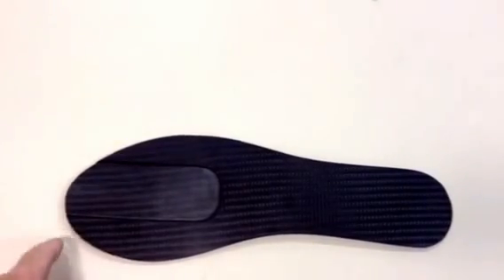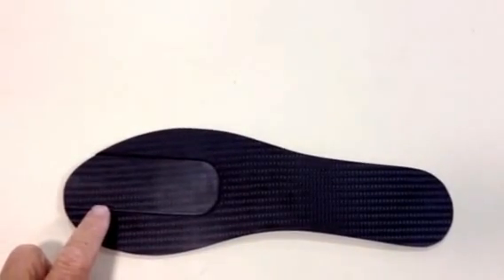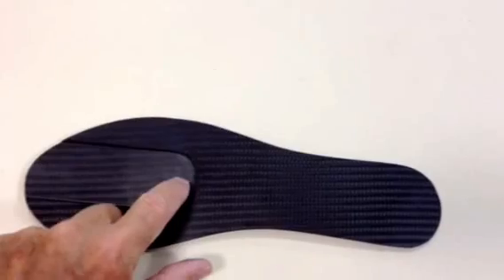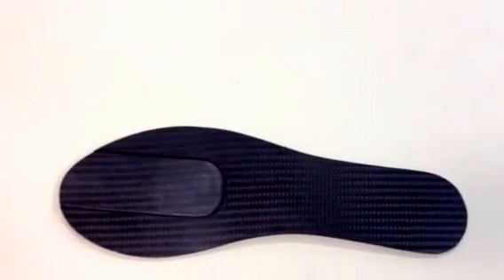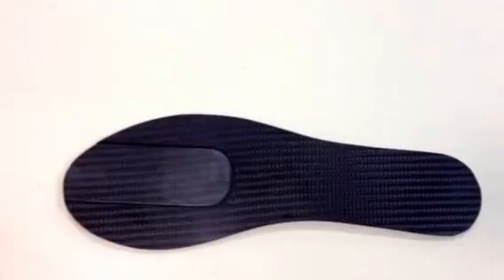This is the new X1 blade for neuroma pain. You can see that there's an offset in the material to kind of unload the third and fourth metatarsals.